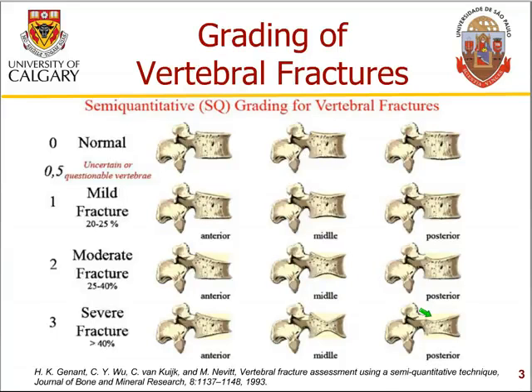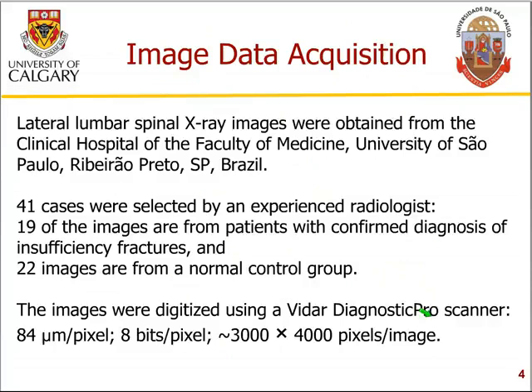So as you can see, the height of the vertebral body changes related to the extent of the fracture, and grading of fractures would therefore require measurement of the height of the vertebral bodies that have been affected by the process or the injury if it is due to traumatic causes.